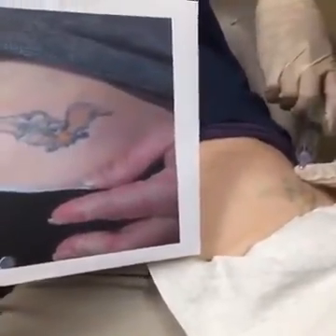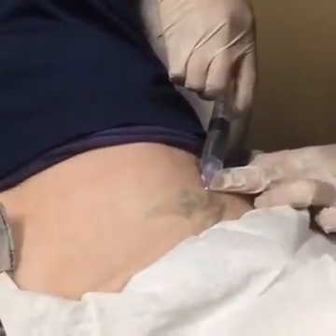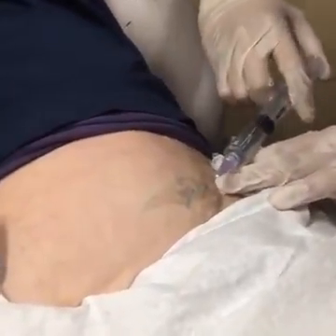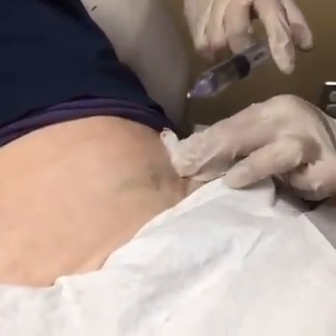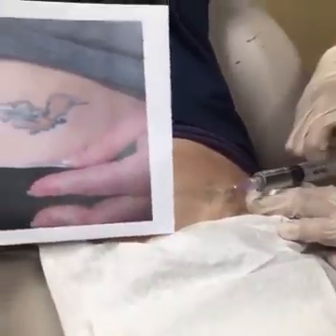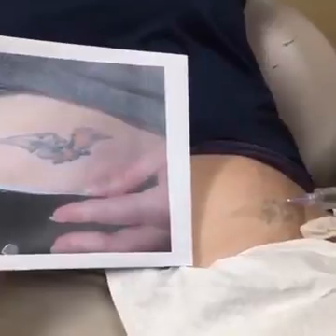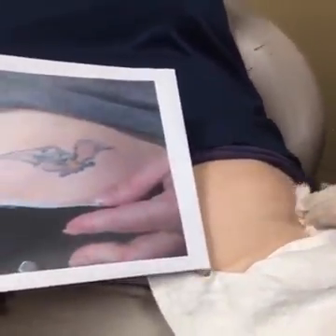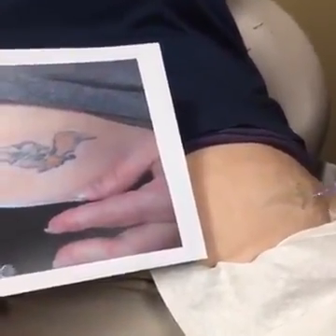And after we get her all numb and we start treating her, what can she expect later today that her tattoo will look like? So the first thing we see is almost like a frost. With the laser, it causes the tattoo to break down. Her skin may blister or peel. We have a way to make that a little more bearable by keeping it very greasy with Vaseline, keeping it from getting a scab, and that can go on for about 2 weeks or so, but it'll get better and better as it goes.